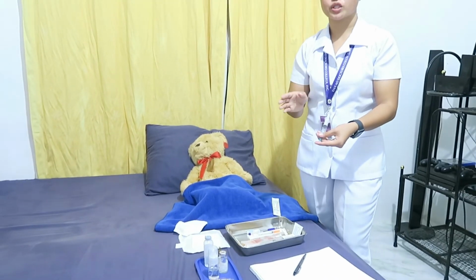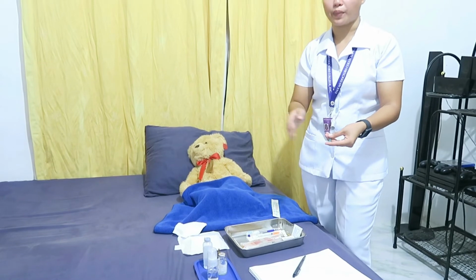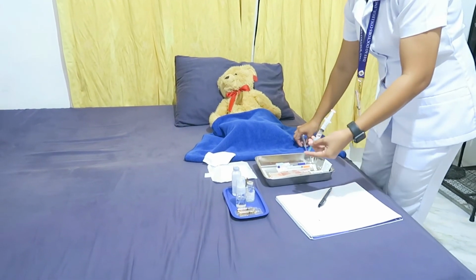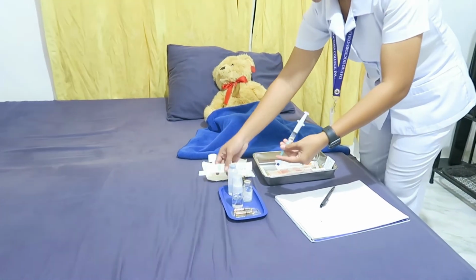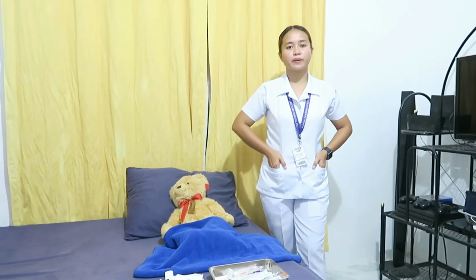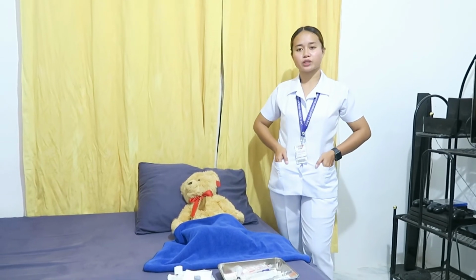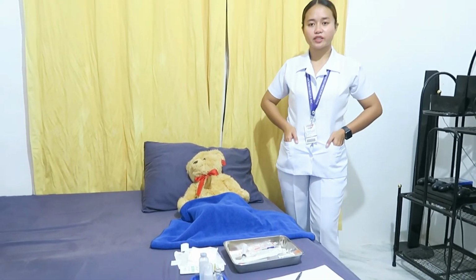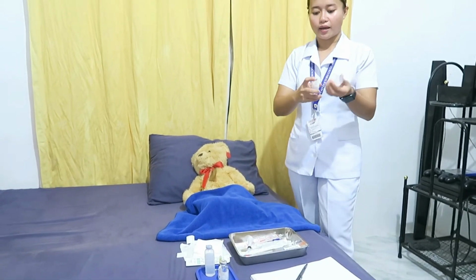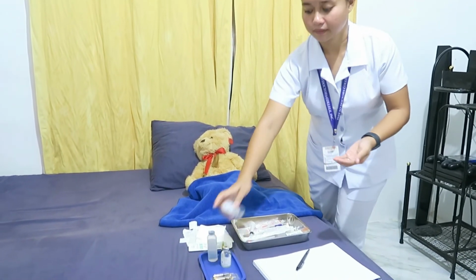Then, the next procedure is to organize the equipment. This is to save time and effort, or energy. So, as you can see, I've already organized the equipment. Next is to perform hand hygiene and observe other appropriate infection prevention procedures. This is to prevent the spread of microorganisms. So let's proceed to our hand hygiene.